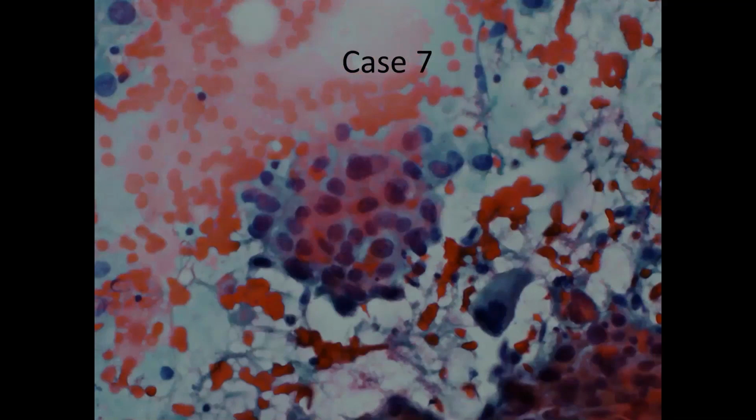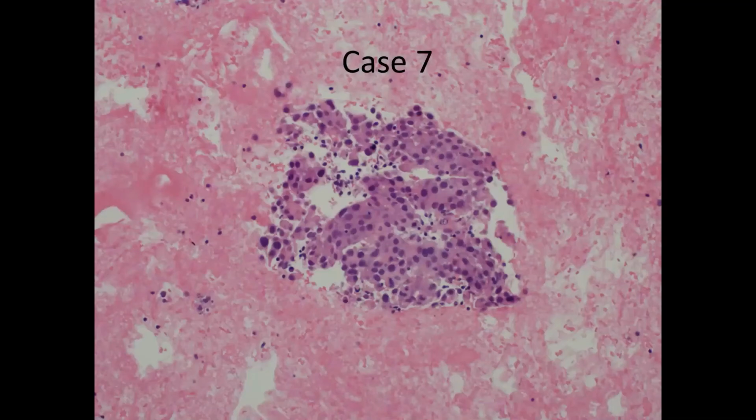And at this point, are we dealing with a primary or a met? Again, looking at the clinical information can help you with that. And as far as what type of tumor we're dealing with, this is a case where a cell block can help you. So here we have a cluster of these cells. Again, it's a high-grade malignancy, lots of karyorrhexis and pycnosis, as well as this pleomorphism and atypia. And you can appreciate the cells have this abundant eosinophilic cytoplasm.